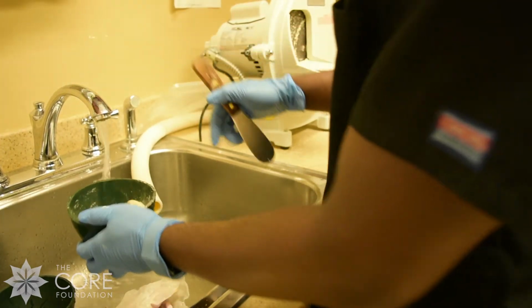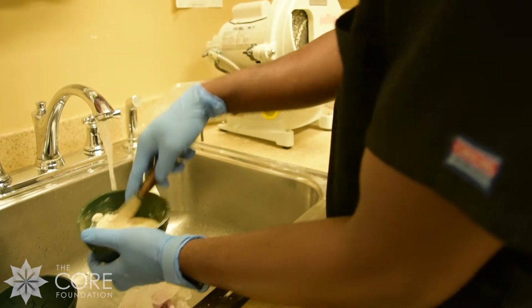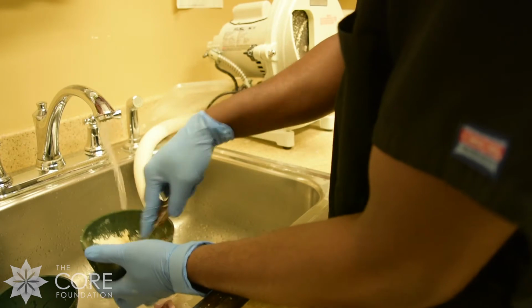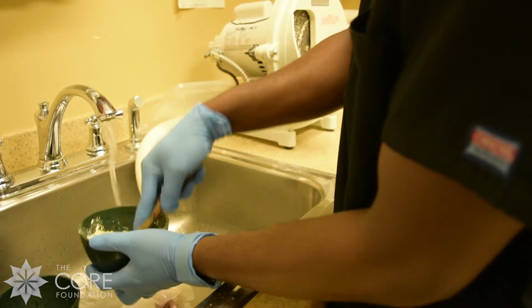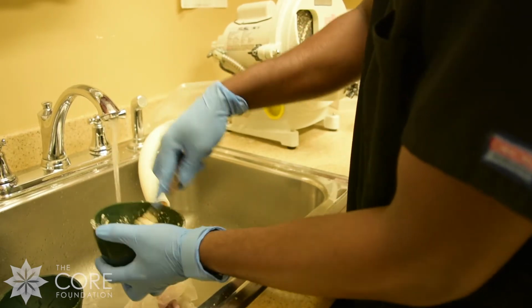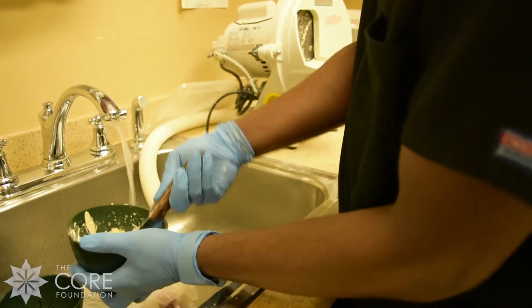All right, so we already have Yellowstone in here, and so I'm going to just get some water. The way to do this, you want to make sure you don't fill it all up with water. You want to do a little at a time, because once you fill it all the way up with water, it becomes really difficult to get the stone to mesh. So slowly with water and also mix.